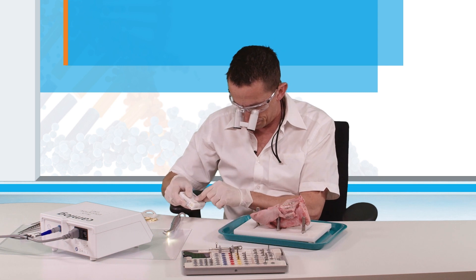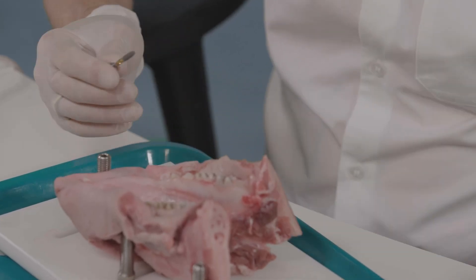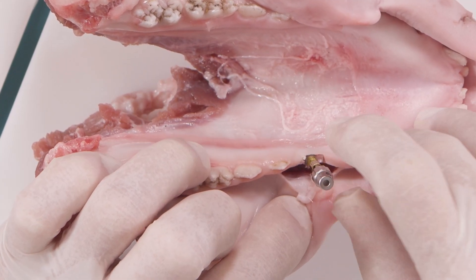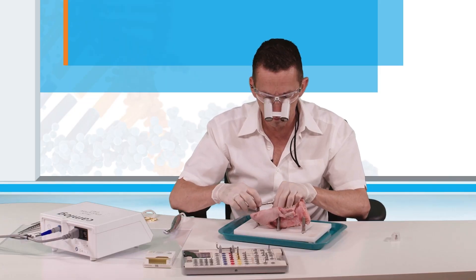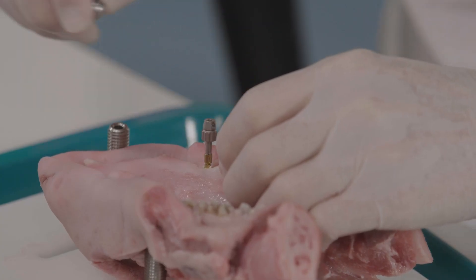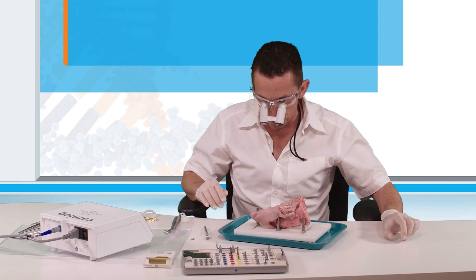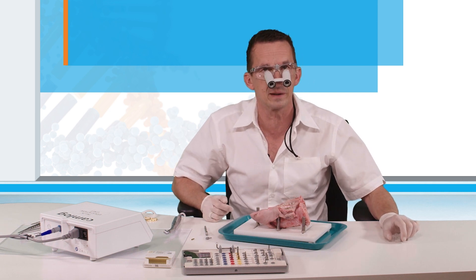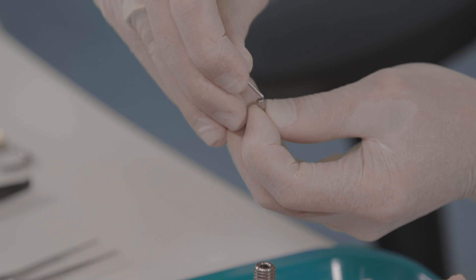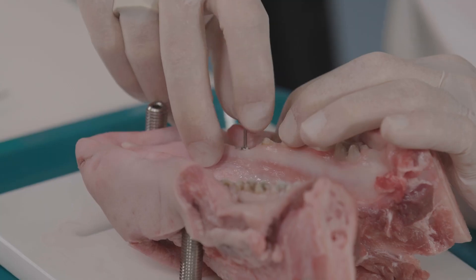Now we place the implant. The implant is in place — or better placed with a healing abutment. The 4.0 gingival height healing abutment is directly put in place. This allows an open implant healing.